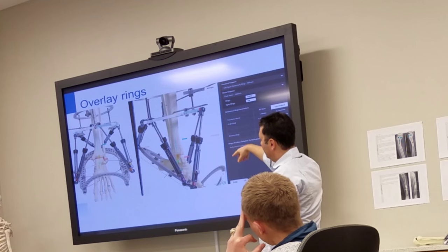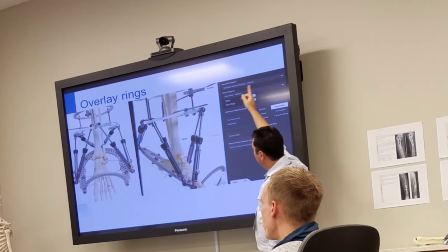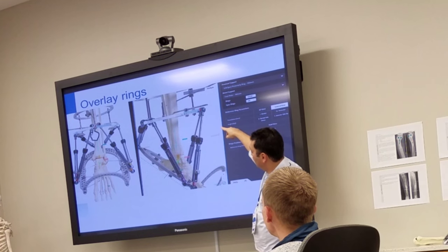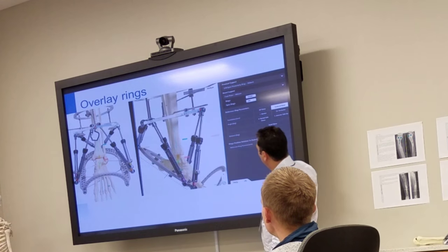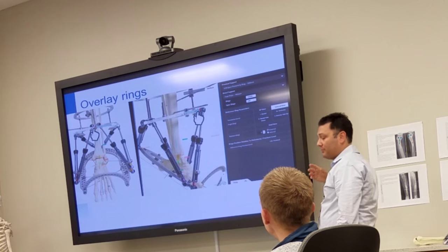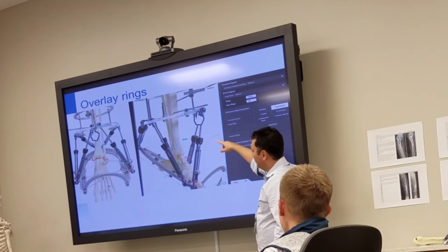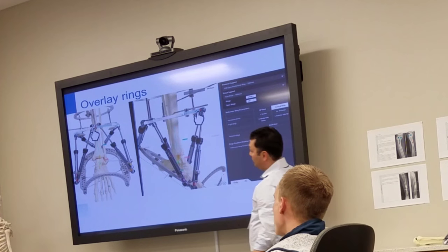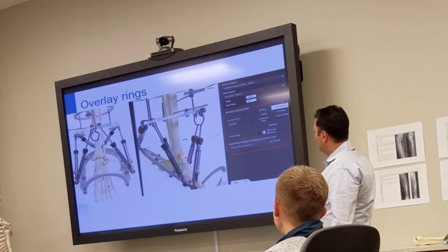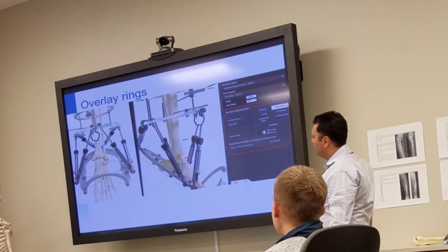The end of correction parameters is how you want it to look. Here's your distraction and here's your correction of the Equinus — really important to note. Lock down how much length you want and move on. You're going to put your rings in. It's going to ask you: place your 160 millimeter open posteriorly five-eighths ring and your foot plate, and it pops down on screen. You measured before — are you anteriorly or posteriorly tilted? You measured your distance from the osteotomy to the ring. The computer is going to make sure your distance is the same spot so you can double-check against the model you built.